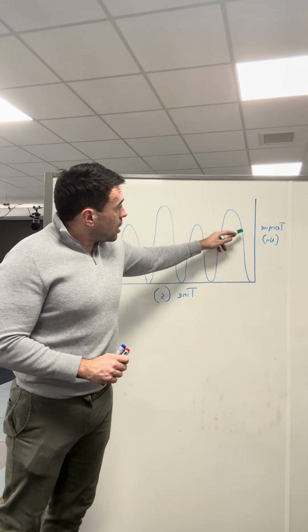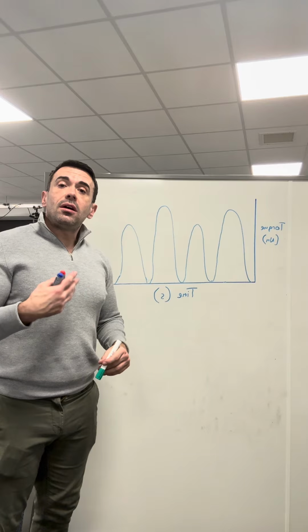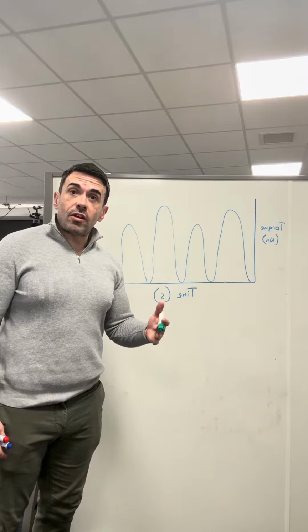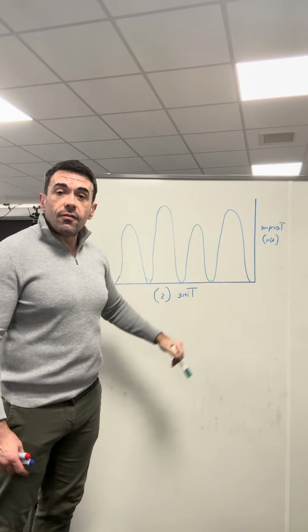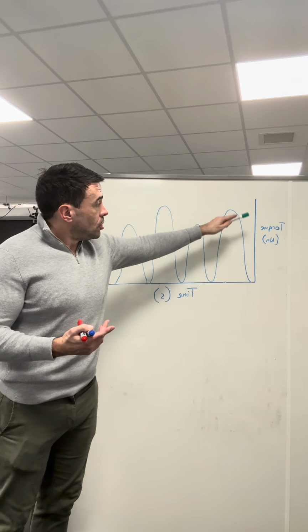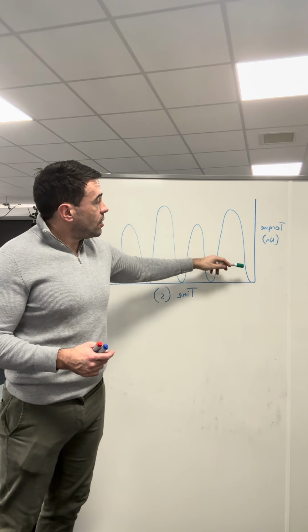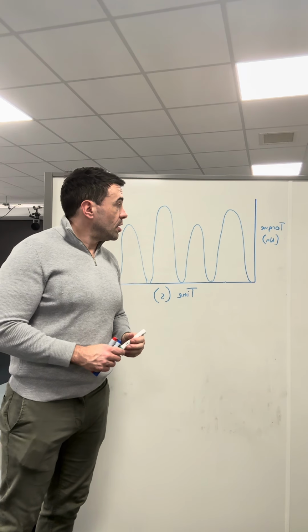The area underneath the curve is angular impulse. So remember, with a kinetic force plate measurement, which is a force-time graph, we have impulse under the curve and rate of force development is the line. In this case, we have the angular equivalent of that: torque in Newton meters, time, angular impulse underneath the curve, and rate of torque development is the curve.